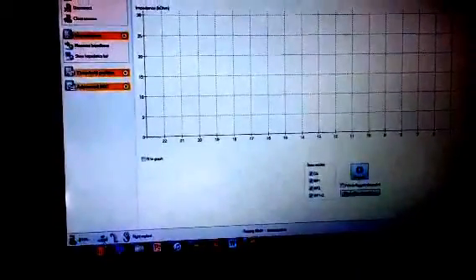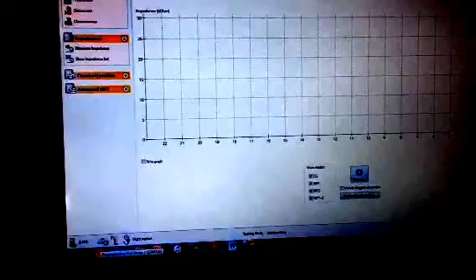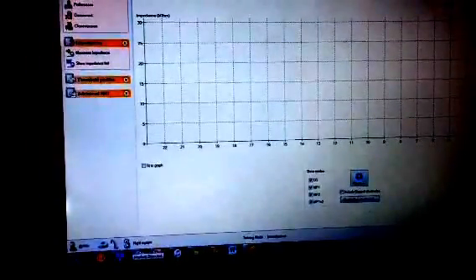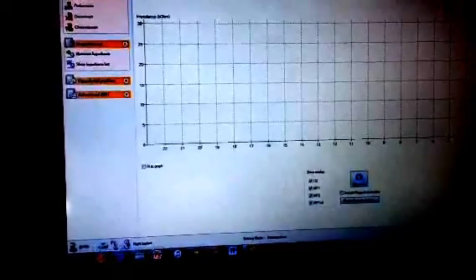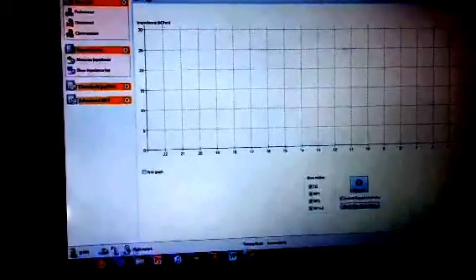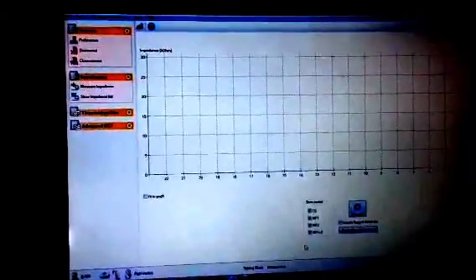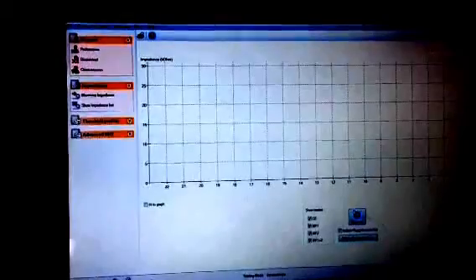On the lower bar here, you can see that the board is connected, your processor is connected, and your implant is connected. If there is any problem in the hardware connection, it will be visible on this screen.